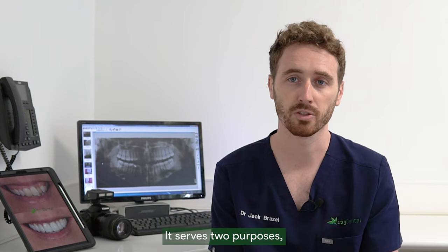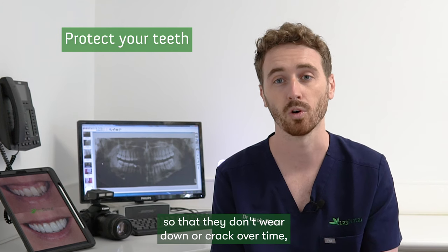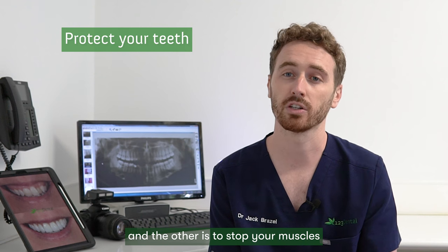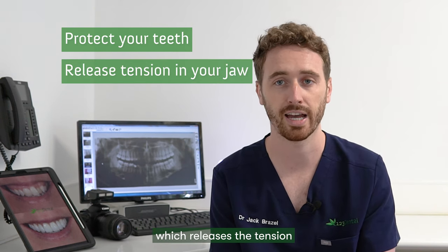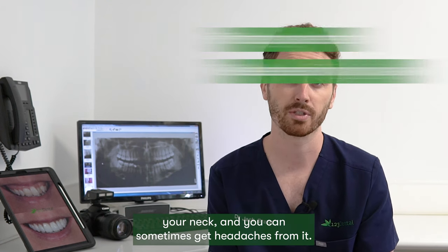It serves two purposes. One is to protect your teeth physically so that they don't wear down or crack over time, which can cause pain and discomfort. The other is to stop your muscles from being able to contract fully, which releases the tension that you can sometimes build up in your jaw and your neck, and you can sometimes get headaches from it.